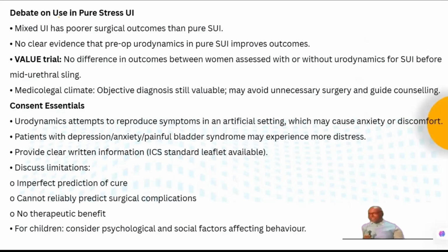Okay, so practically speaking, in pure SUI, when a surgical treatment is being offered, urodynamics may not be required. However, because of the medico-legal climate, it's always better to have an objective diagnosis. It's still valuable and it may avoid unnecessary surgery, and it will help us to counsel the patient appropriately. Okay. So we need to discuss with the patient why exactly we are doing the urodynamics.